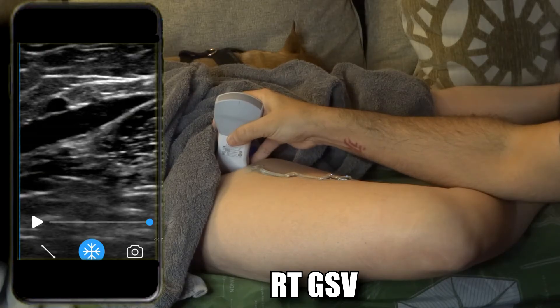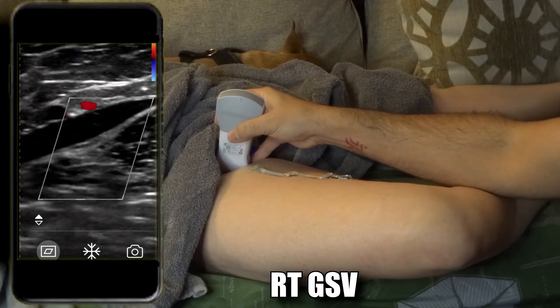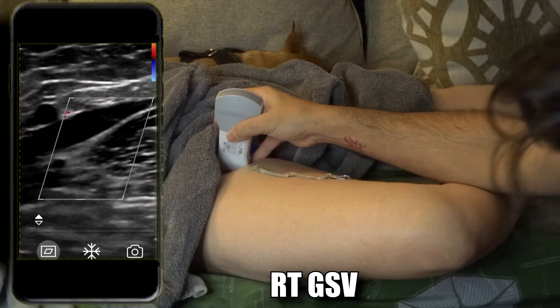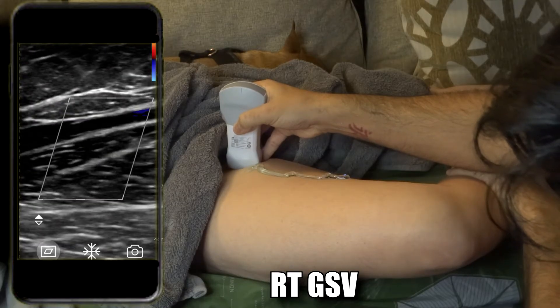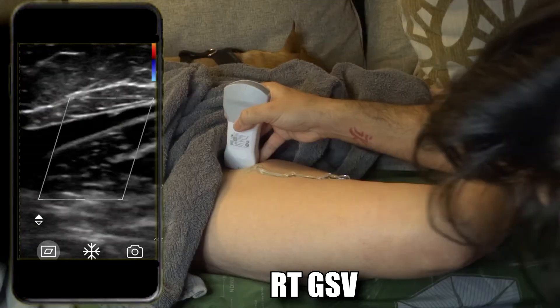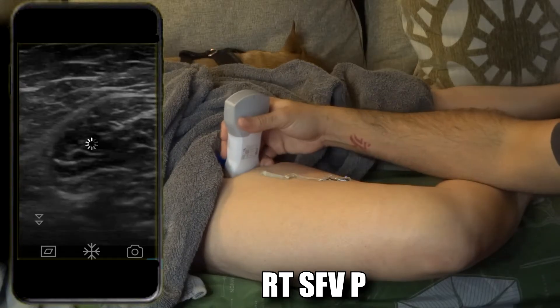Take that picture, then put color Doppler on. It's not picking up color — that's probably because I'm pressing too hard and compressing the vessel. Release some pressure and you start to see a little bit of flow. Try a little augmentation — there you go. Freeze, rewind to a good spot, take that picture, unfreeze.